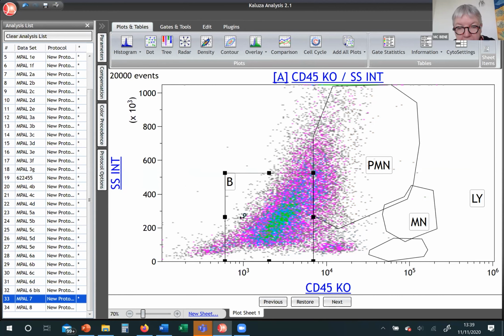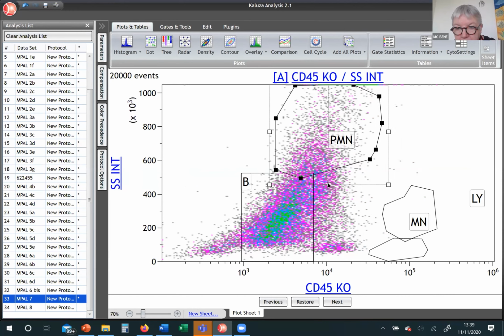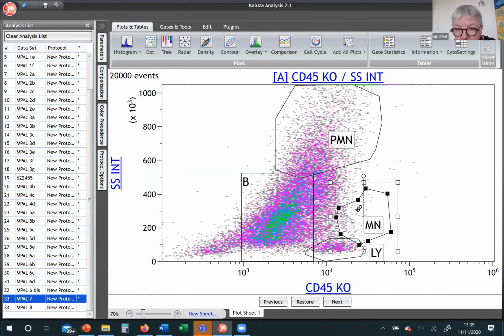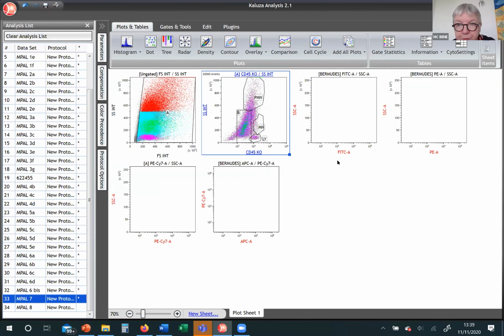M3 is really looking like the polymorphonuclears have fallen down. I guess that these polymorphs are something like here. We'll see afterwards what's going on. Now a few lymphocytes here, and perhaps some monocytes here, but I'm not sure. Something like that. So let's see what it looks like.